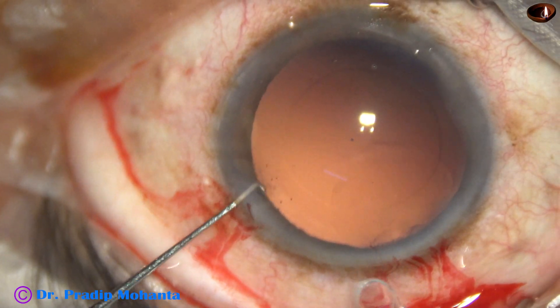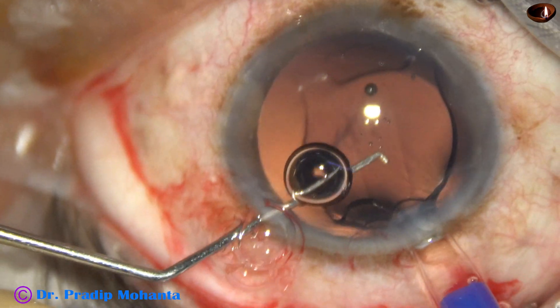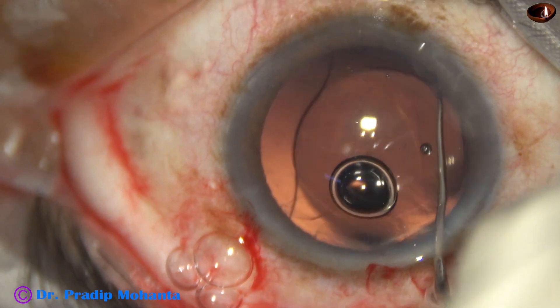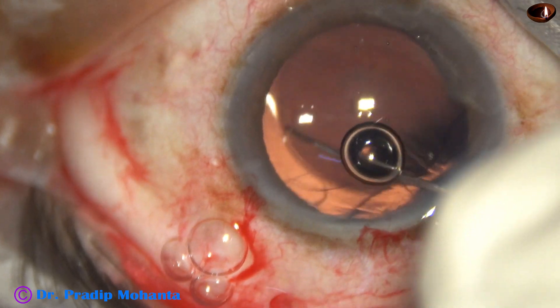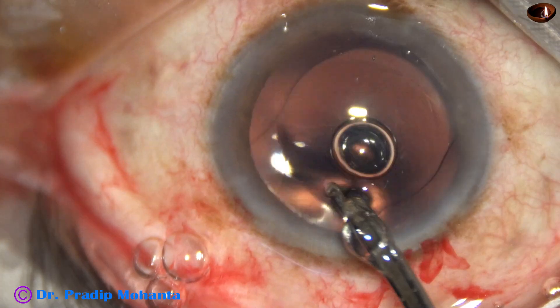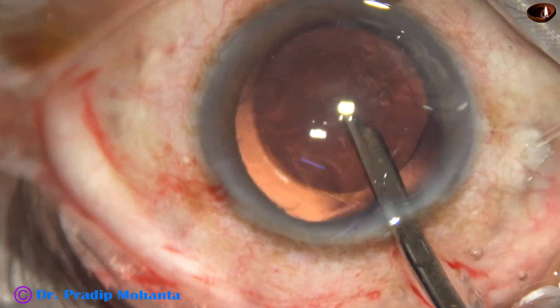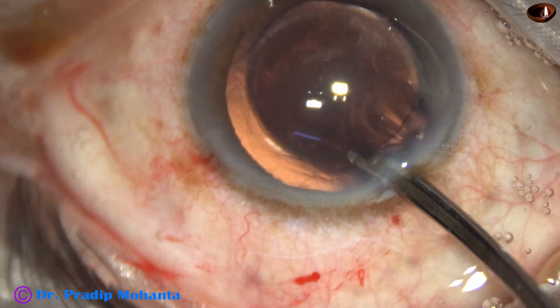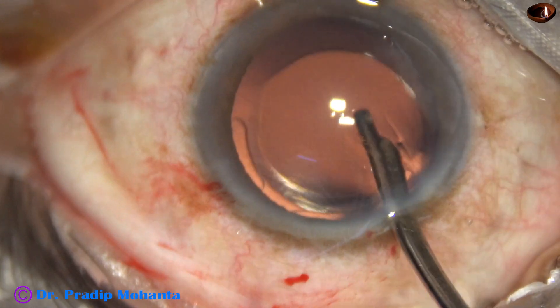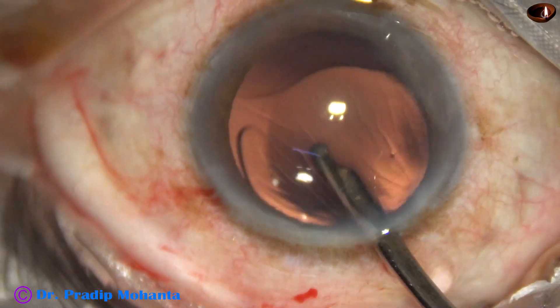Now the lens is injected. The leading haptic goes into the capsular bag and the trailing haptic also goes into the bag as we place the haptic-optic junction with the chopper. Now we are going to remove the viscoelastic. Without visco this lens may also be implanted, but in this case I opted for implantation under visco.